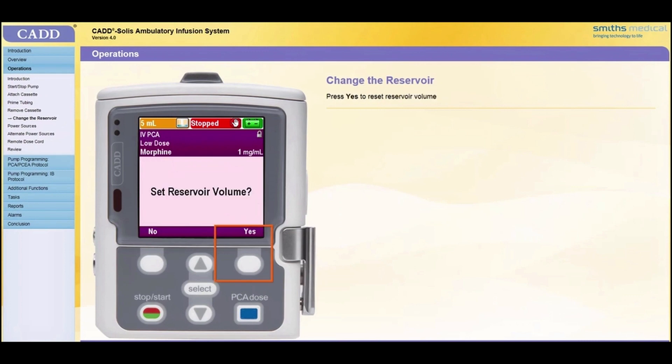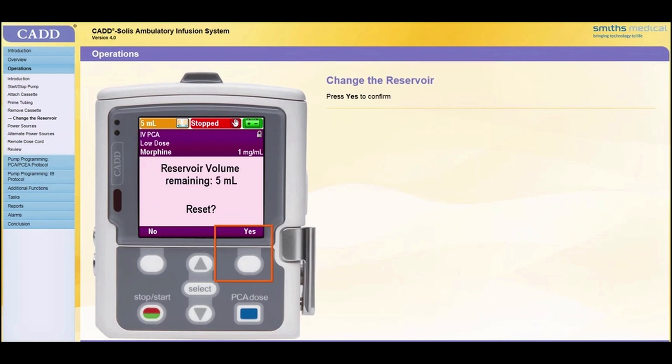Use the pump key to re-lock the latch handle. The screen will display prompts to perform various tasks. First, it prompts to reset the reservoir volume. In this case, the reservoir has been changed, so press Yes. Confirm the reservoir volume reset by pressing Yes.